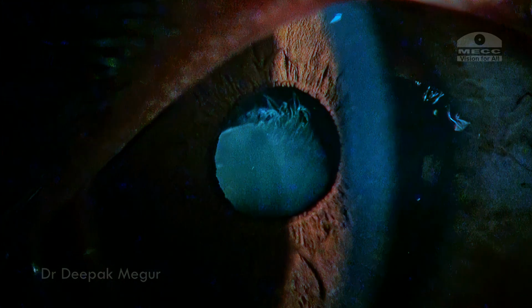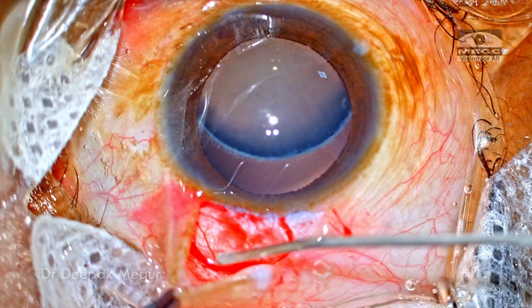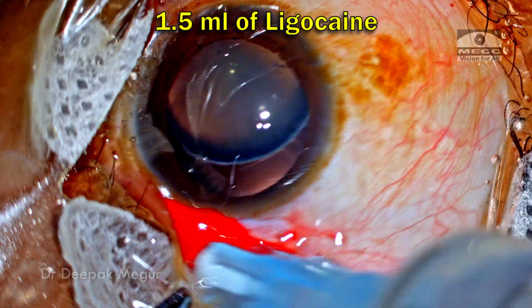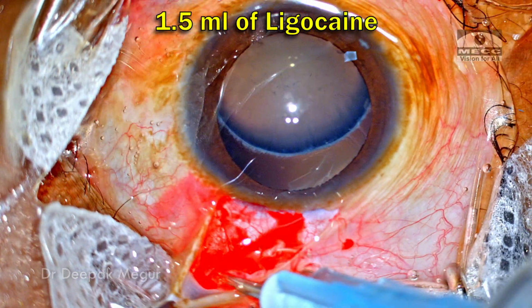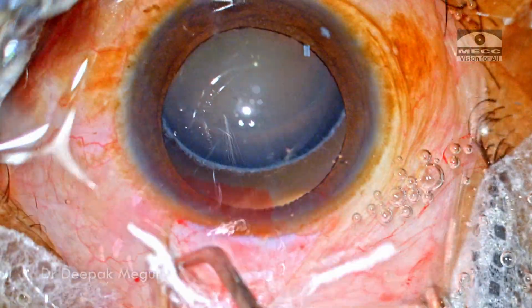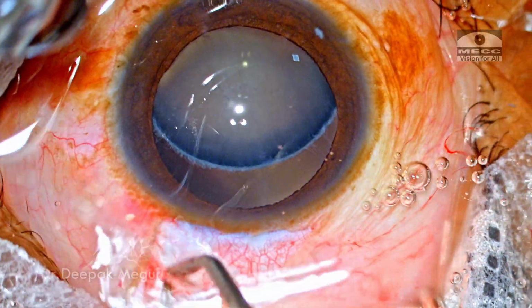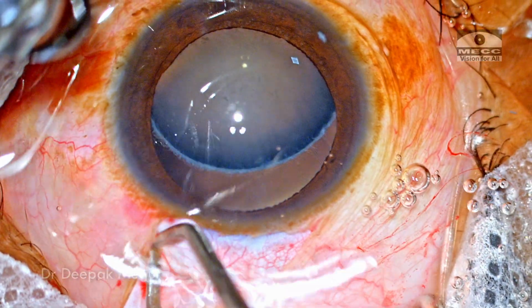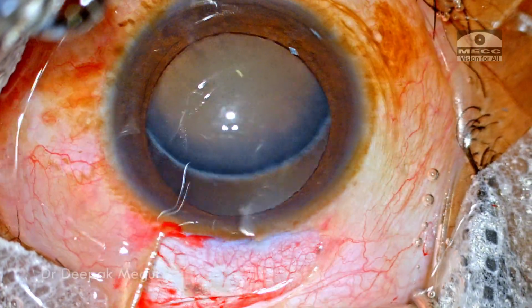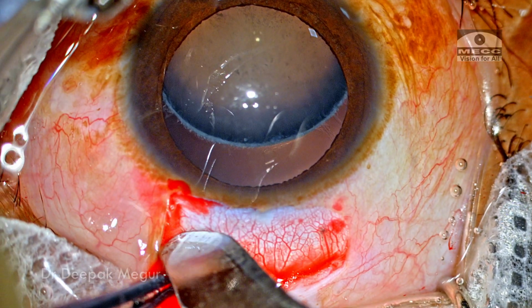The conjunctival flap is raised, and using a blunt cannula, I'm injecting 1.5 ml of lignocaine into the posterior subtenon space. So this is going to give me enough analgesia and reasonable akinesia to manage the case. Very little cautery is used to address the bleeders on the episcleral surface. A posterior scleral groove is used for fixation, and the globe is stabilized with the Hoskins forceps.